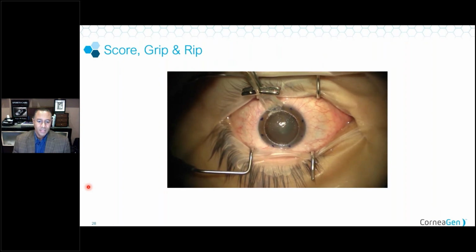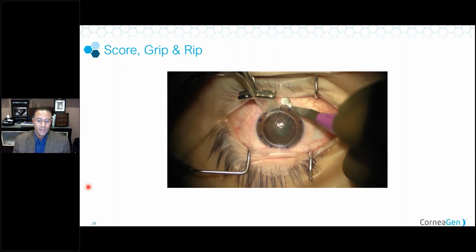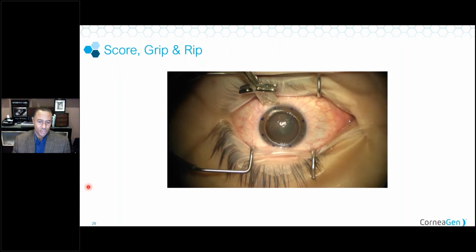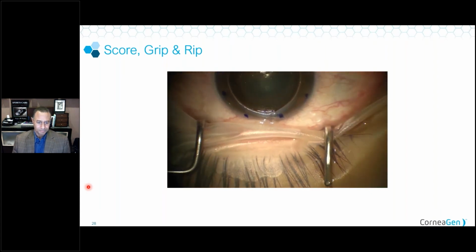Then I take the feather blade again, and from the periphery back to the center, complete that cut from the back side. There's lots of ways you can do that. Of course, you can do that with scissors or however you feel comfortable. It's just an easy way to do it.